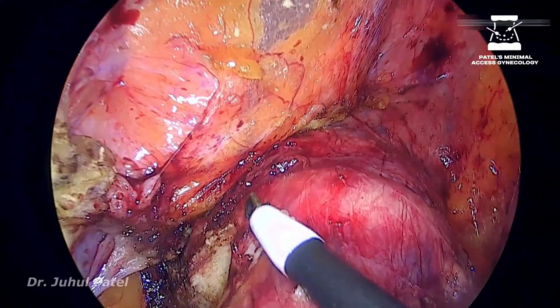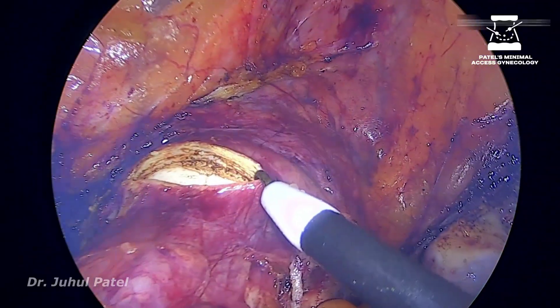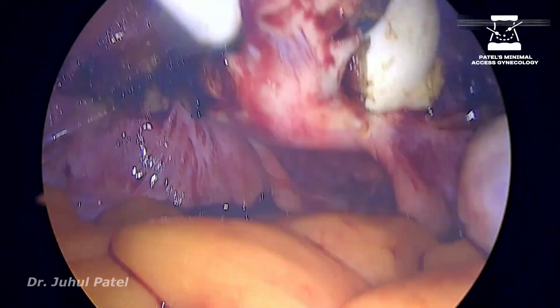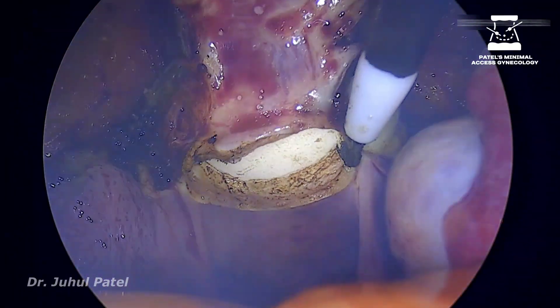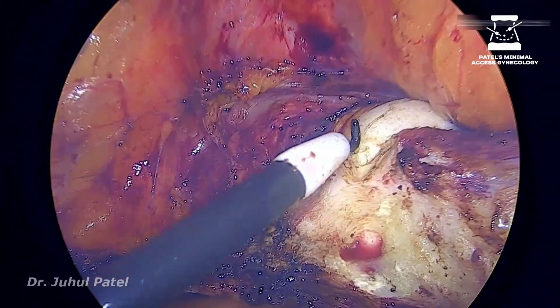To do the colpotomy, as I mentioned before, the best instrument I like is unipolar. You need to be slow because unipolar doesn't have a sealing capacity to that extent. So if you are slow, it will also coagulate along its path.